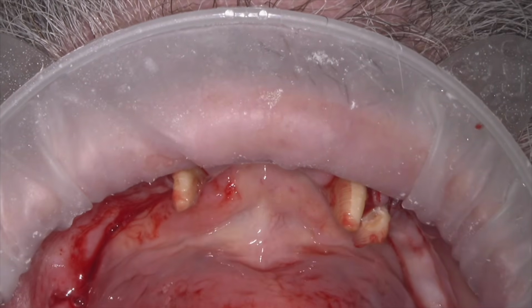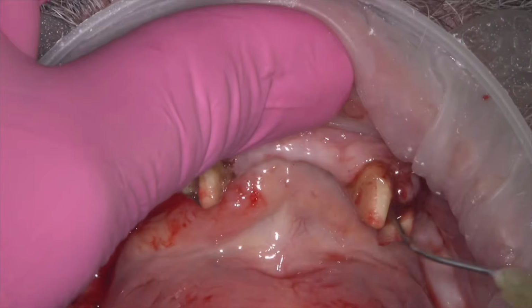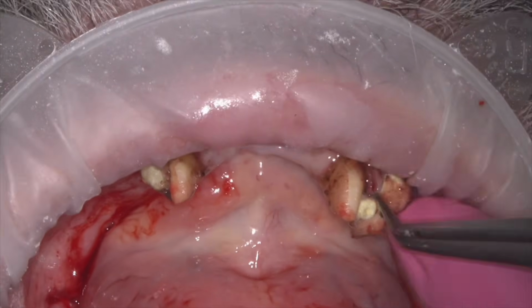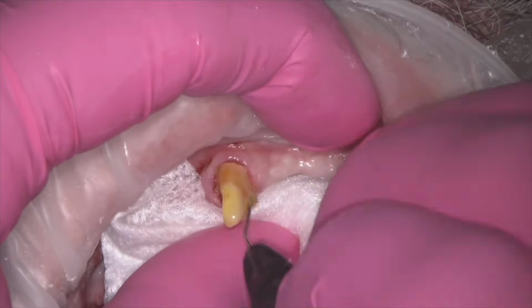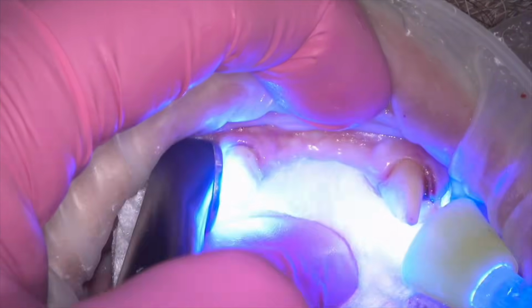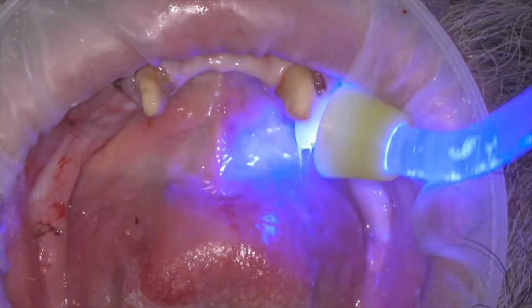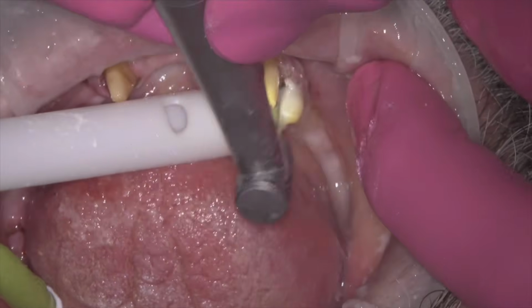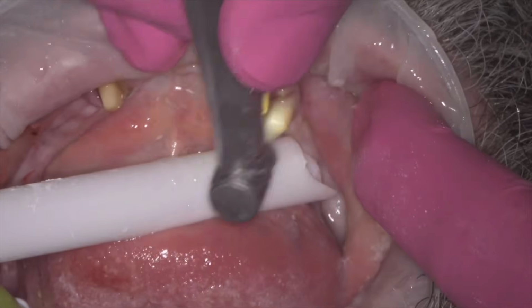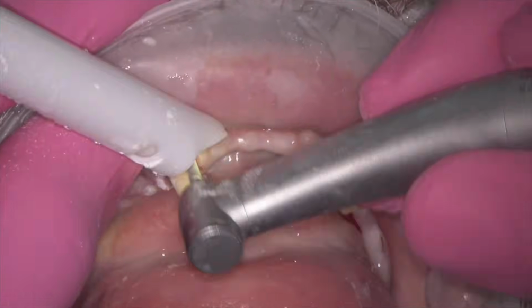But here I am removing decay all the way around these teeth, and then I'm going to go ahead and get isolation. These are epinephrine impregnated cotton pellets with aluminum chloride, and I'll probably just do some quick isolation here. Normally I would do Brinkner B4 clamps and rubber dam isolate, but I'm just really moving fast today. I'm going to fine tune those preps really quick after I do the cores, and I'm having to lean some preps due to the path of draw cross arch so that I could get everything super nice.